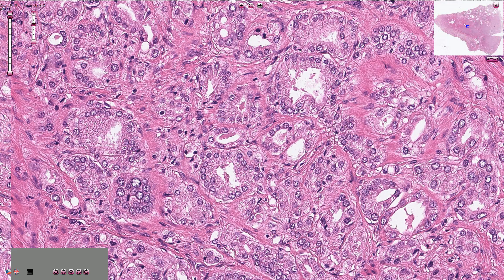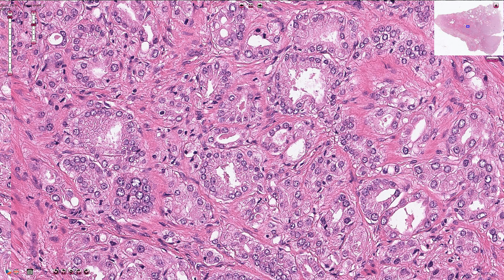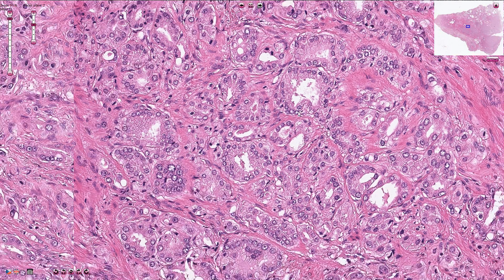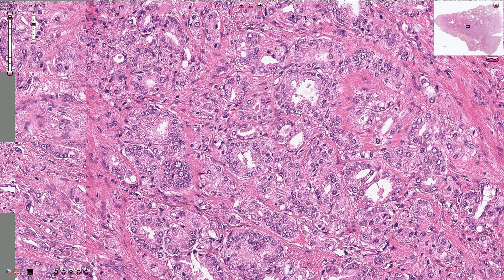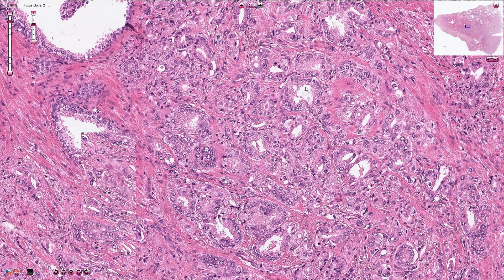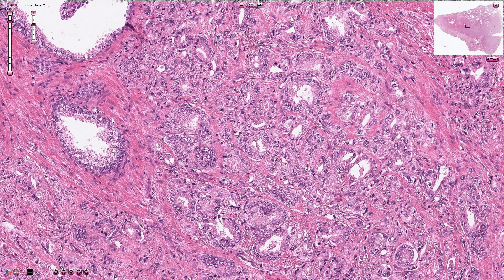If you want to confirm that basal cells are absent, we can run immunohistochemistry for either p63 or a high molecular weight keratin, which would stain the basal cells. Both of these immunohistochemical stains would be negative in the carcinoma and positive in the benign part of the prostatic parenchyma, for example here.